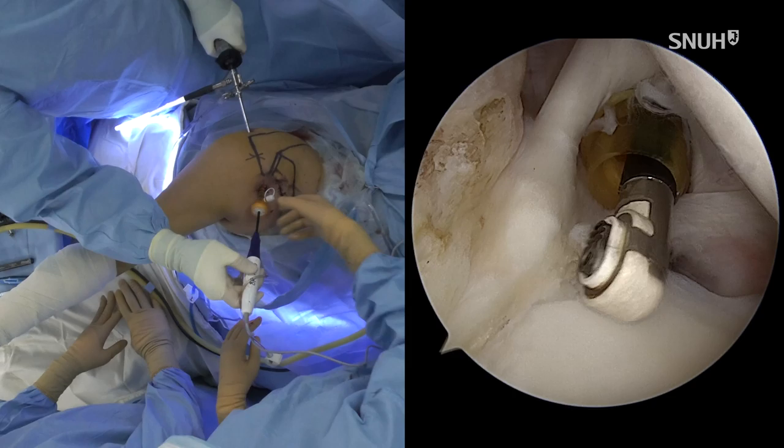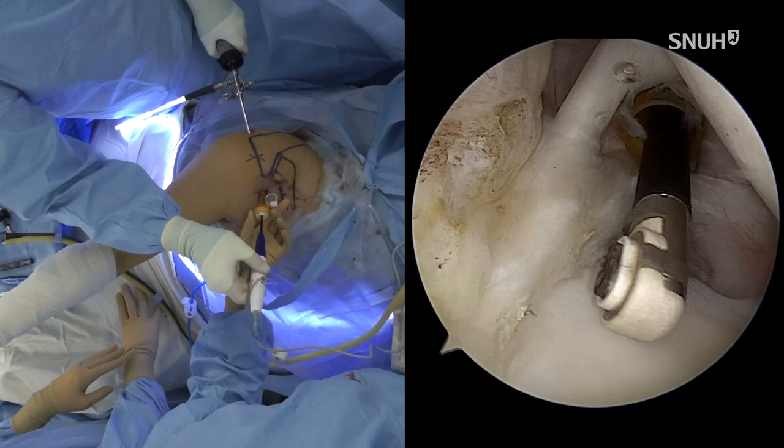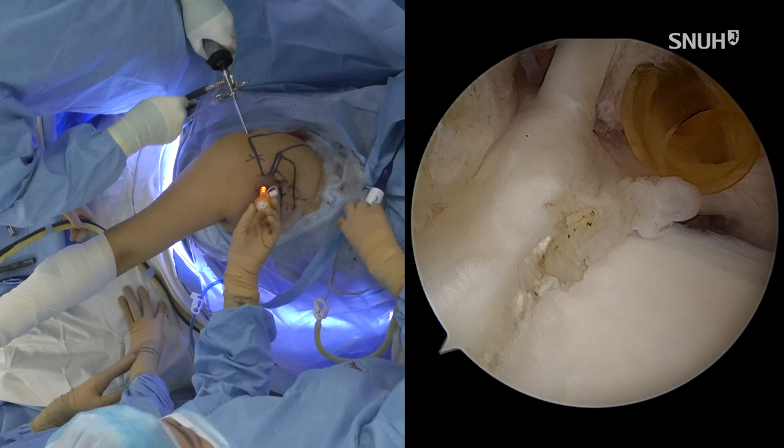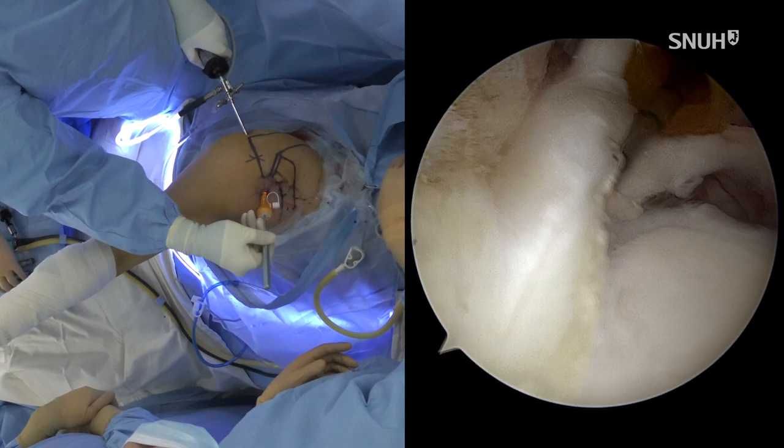to the 1 o'clock or 2 o'clock position. Probably fixation to the anterior side causes limitation of external rotation. So I like to stay back, 10, 11, 12 o'clock. That is the position of the SLAP repair.